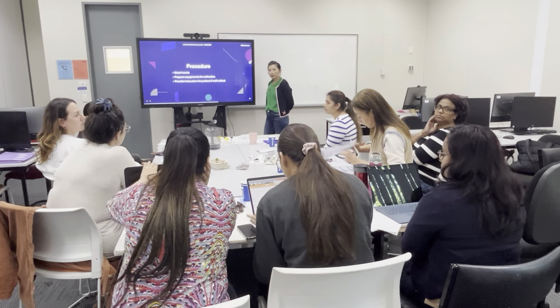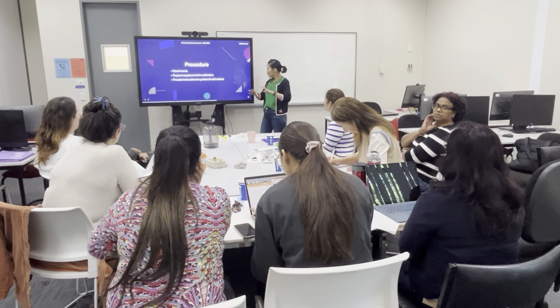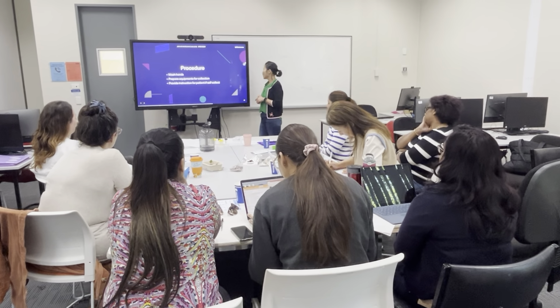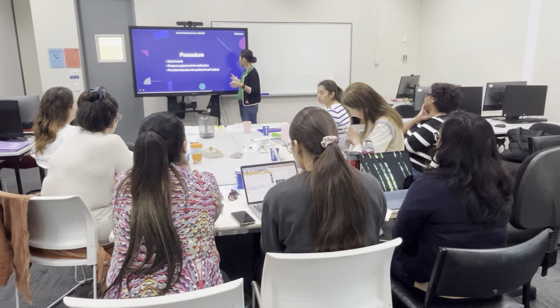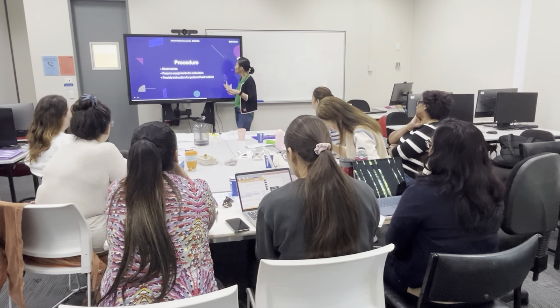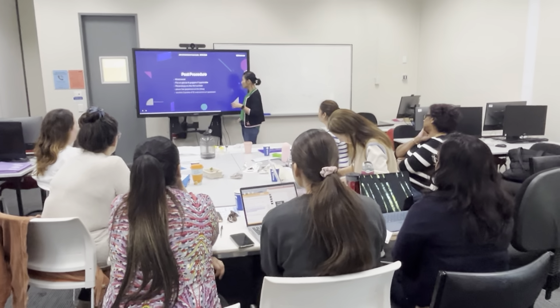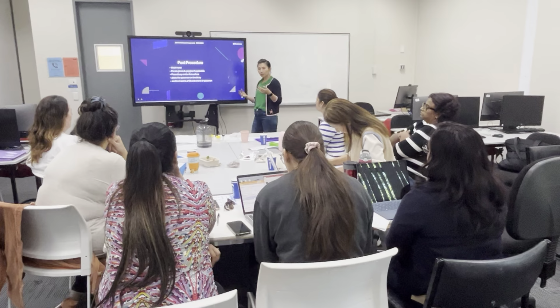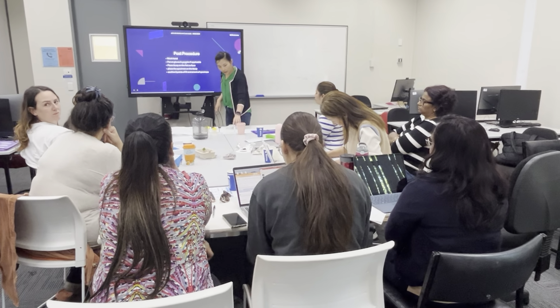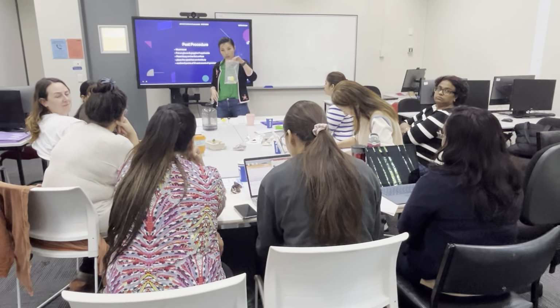So the procedure will involve washing your hands, preparing the equipment you need for the collection, and also providing instructions to the patients if they need to self-collect. When you receive those specimens, they will come in something like this bag, with the specimen inside, okay?